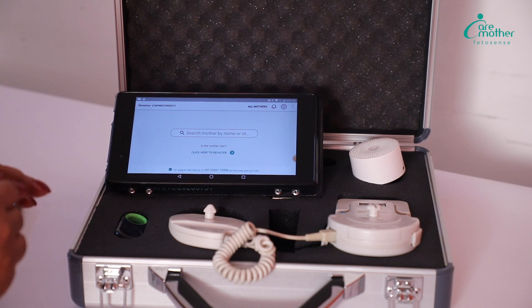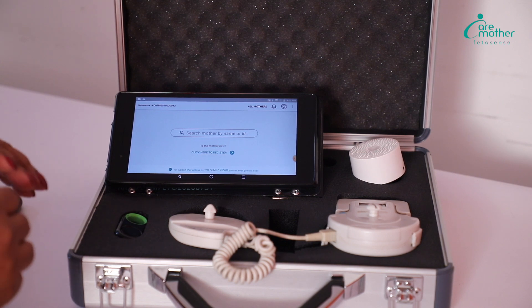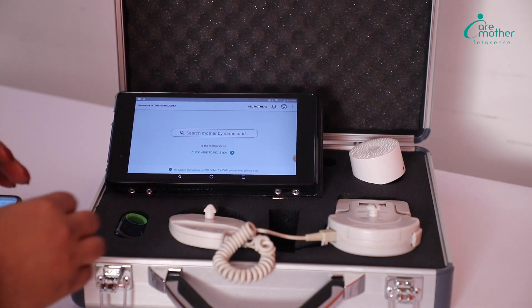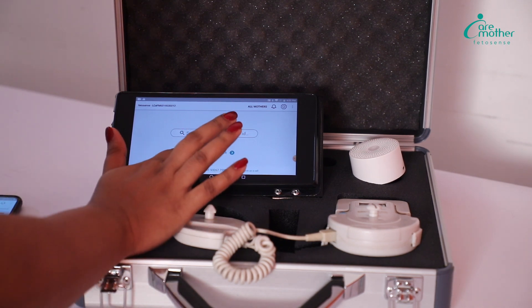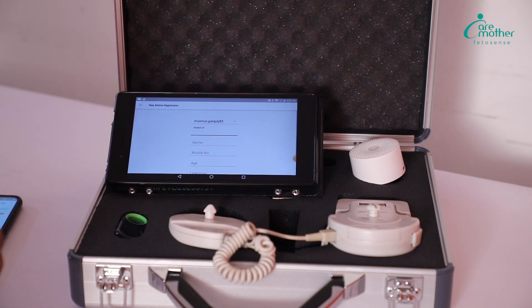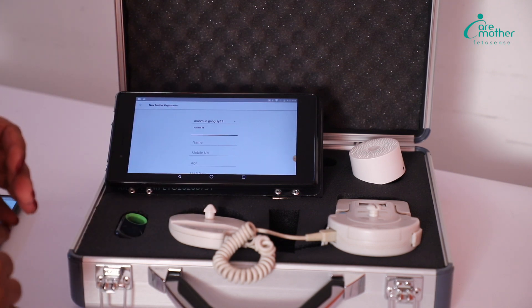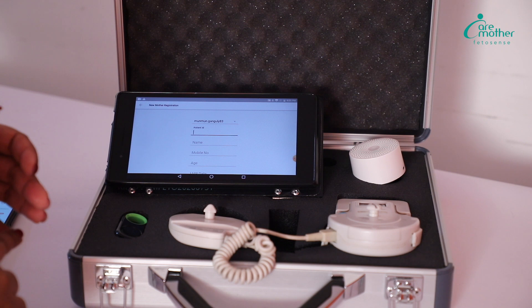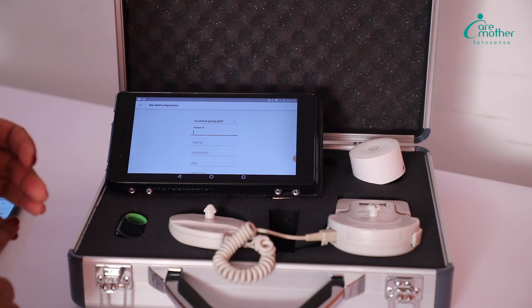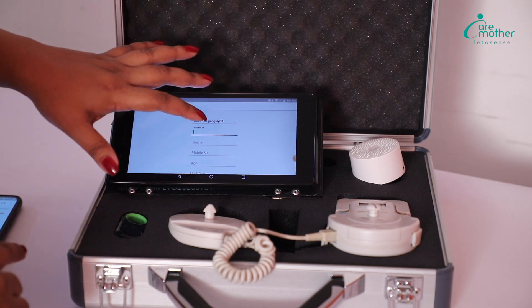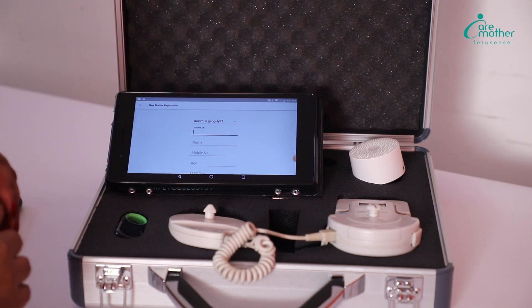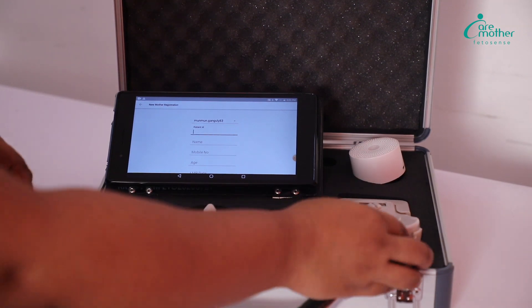For the first time the patient comes for the test, we need to register them. We will click 'Register'. We will need to put in the patient's name, age, mobile number, and LMP to register them.